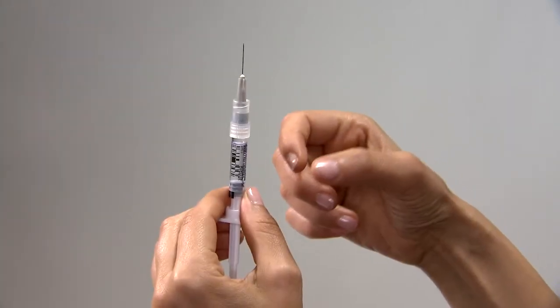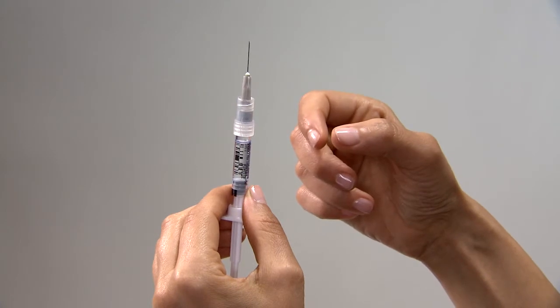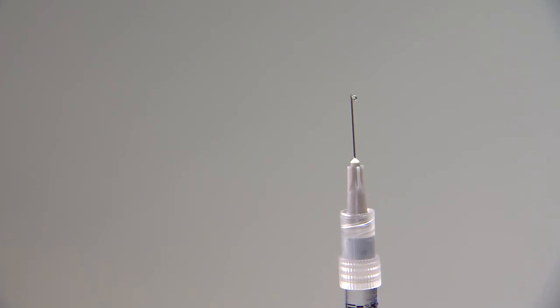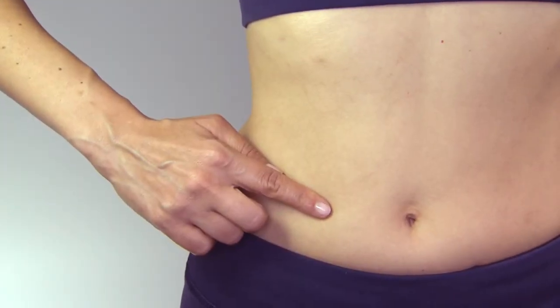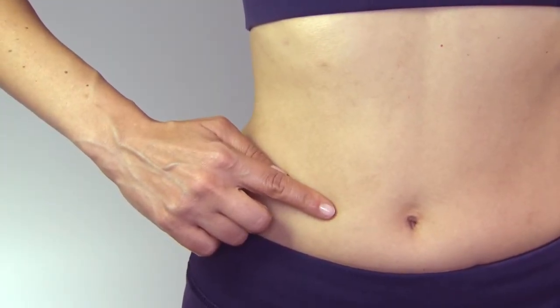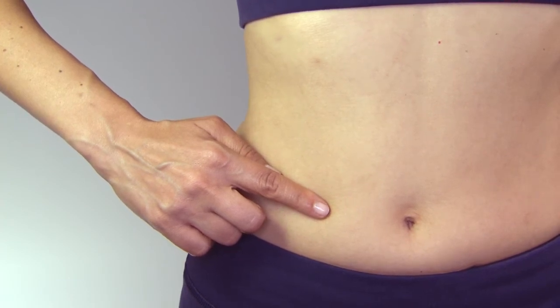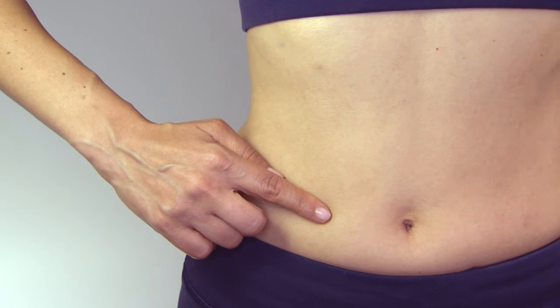Step 3: Inject. Remove any bubbles by pointing the needle up and tapping on the syringe. Push the plunger carefully until a small drop of liquid begins to appear from the tip of the needle. Choose an injection site in the lower abdominal area, preferably around the belly button but at least one inch away. Choose a different injection site each day to minimize local irritation.